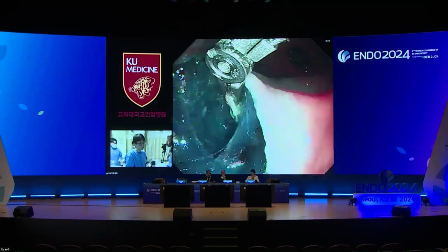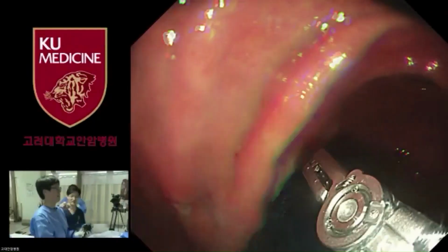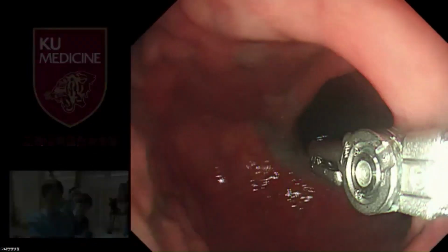Okay, Professor Keum, the case is almost done. Yes, we are done. Congratulations on your excellent performance, Professor Keum and Professor Jeon. Thank you. And also we can enjoy your more cases in the afternoon session, right? Yes. Thank you very much.